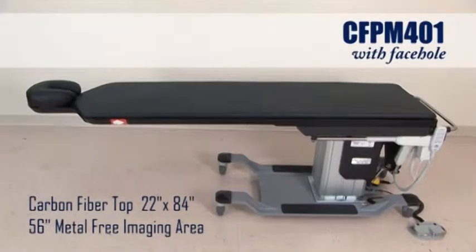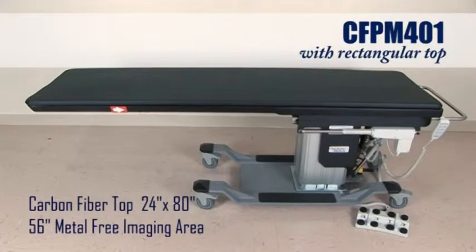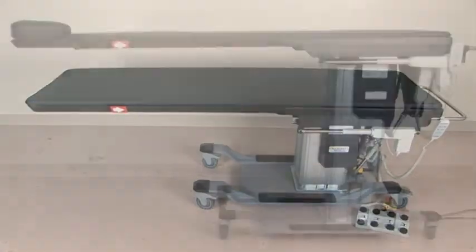The face hole version has a 22 inch by 84 inch carbon fiber top with 56 inches of metal free imaging. The rectangular top has a 24 inch by 80 inch carbon fiber top with 56 inches of metal free imaging area.